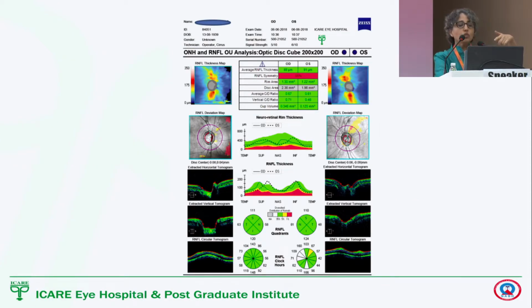So now if I was to draw a vertical axis, there it is straight, and if you make a vertical axis in a torted disc, it is like this. It's shifted by about 15-20 degrees, and hence the RNFL is also exiting the optic nerve head in that tilted manner. And because it's coming out 15-20 degrees away, the machine picks up a deviation here, which is not the normal that it has in the normative data.